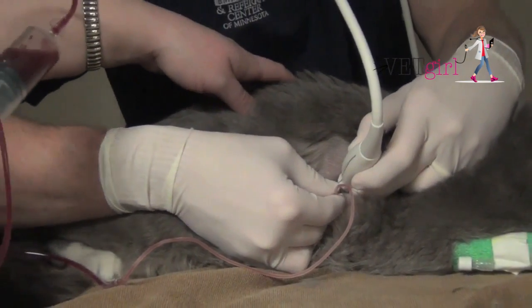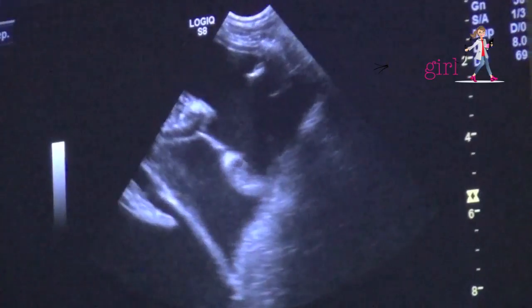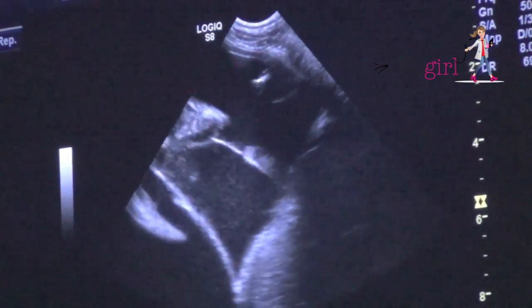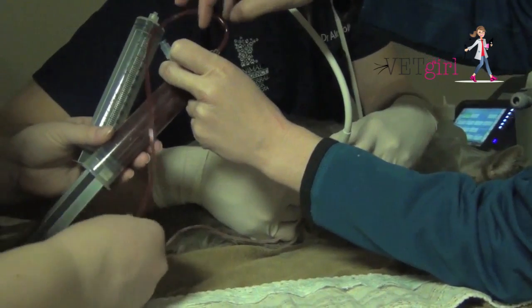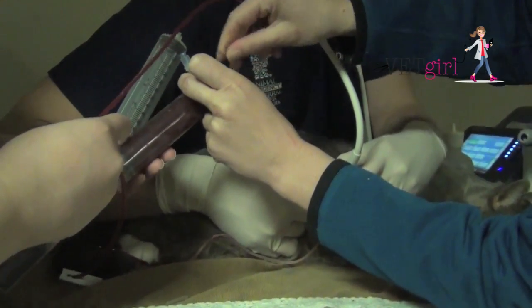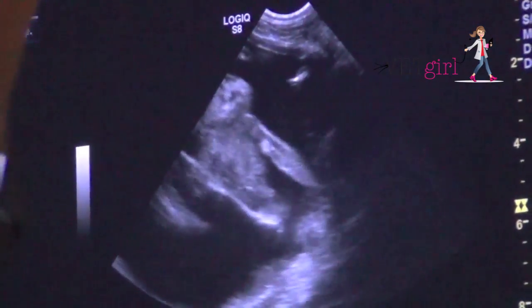Here on repeat FAST, you can see there's still a significant amount of pleural effusion. We're actually saving the pleural effusion — because it was quite hemorrhagic — in sterile 60-mL syringes in the event that we need to autotransfuse it. On repeat FAST ultrasound, we can see there's a dramatic improvement in the reduction of pleural effusion.